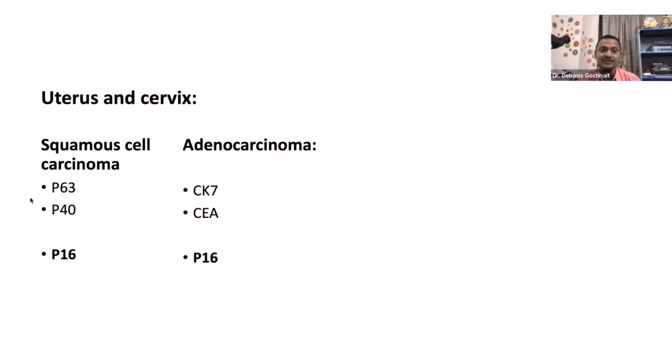Now adenocarcinoma will not be positive for squamous markers, they will be positive for CK7. Okay, cervix. If we have a doubt, then we will use this marker.